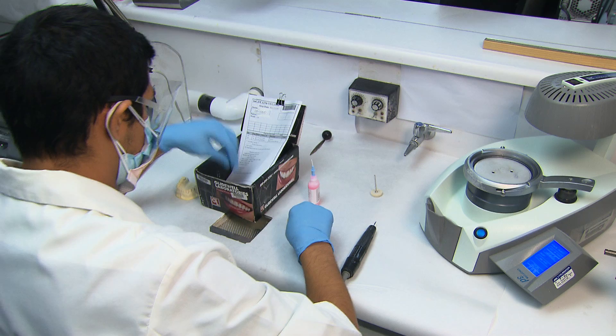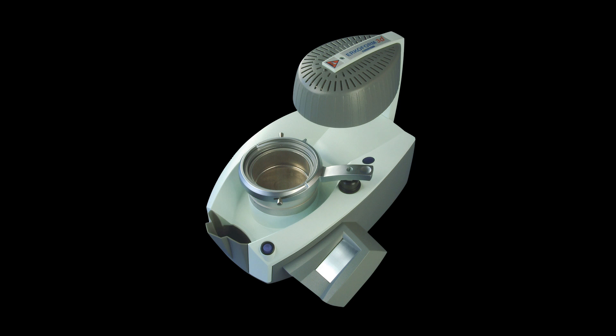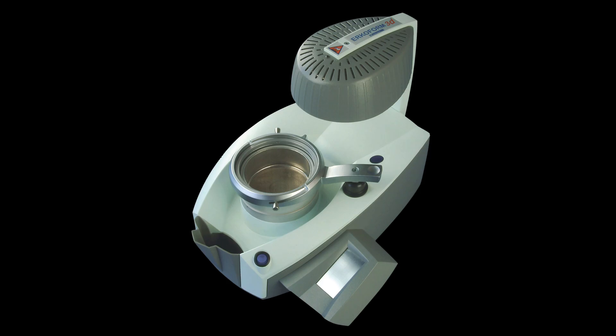Once on the production floor, we use the ERCODENT line of thermoforming systems and materials to fabricate our appliances. For Clear Lock retainers specifically, we use the ERCOFORM 3D vacuum forming unit with ERCODUR discs.